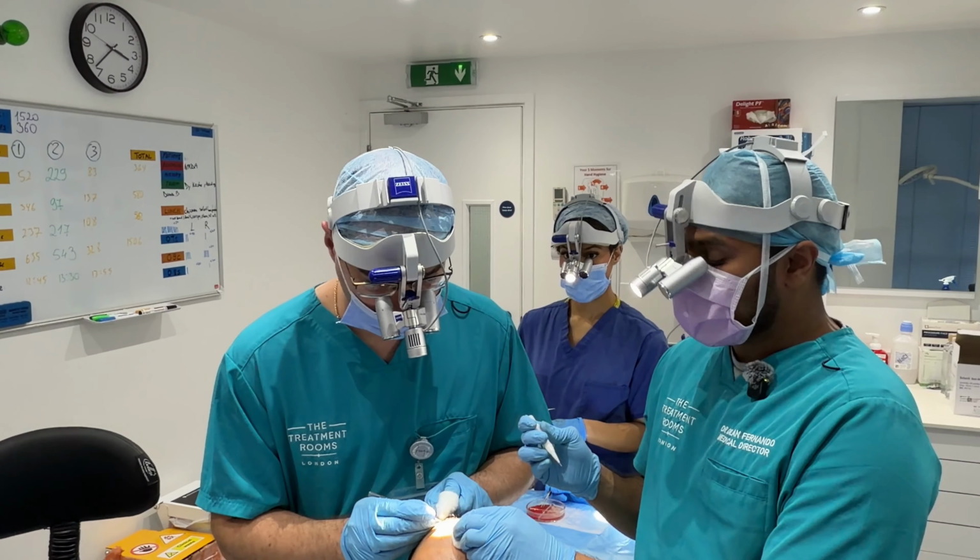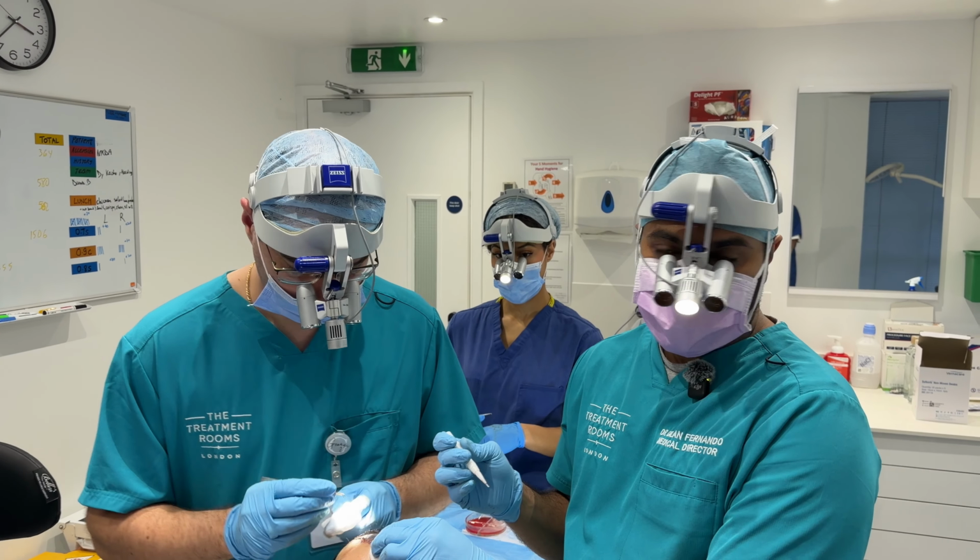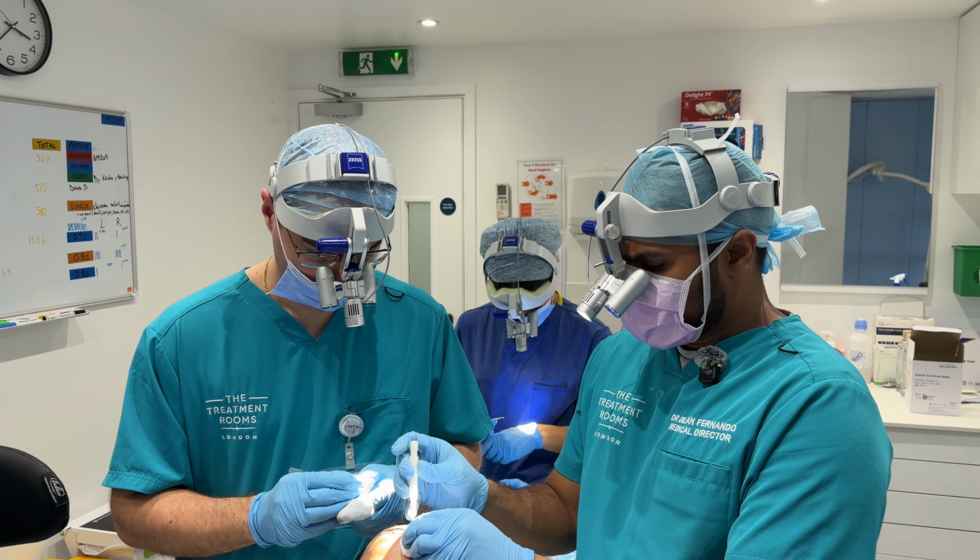And again, it's just taking that time, endeavoring for high quality grafts, and making sure that they go in good time. And like I said, usually we would have even more people on the scalp, but in today's case, where the directions are slightly awkward and difficult, it's easier to have myself and Georgia as two people with full access to all the different angles and directions, to make sure the hairs and grafts can go in a nice streamlined fashion.